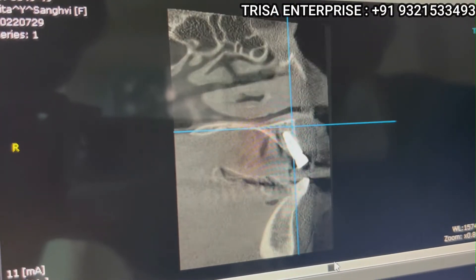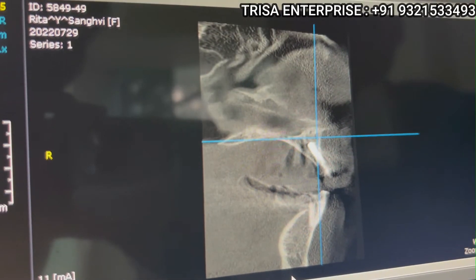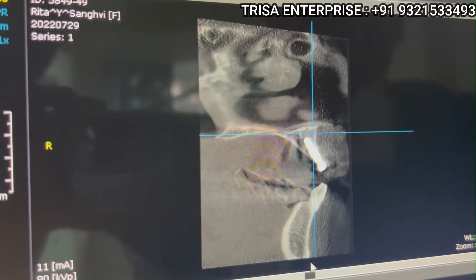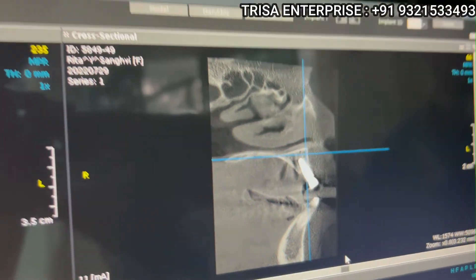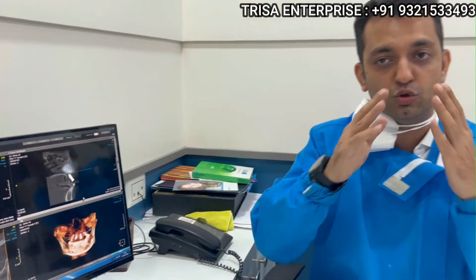Whatever section the radiologist provides — whether this section, that section, or any other — when you see only a particular printed section, you may arrive at a diagnosis that is not correct. Nowadays we are placing angulated implants, but the printed sections are just random perpendicular sections, not necessarily aligned to the axial position of the implant.